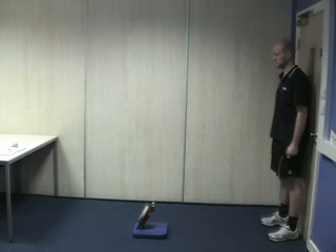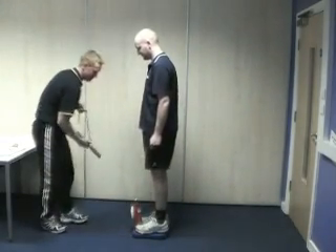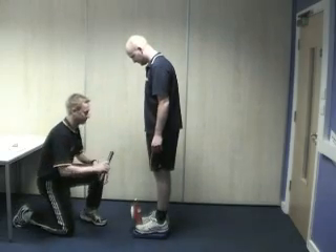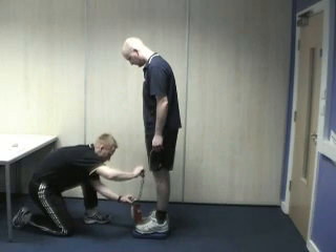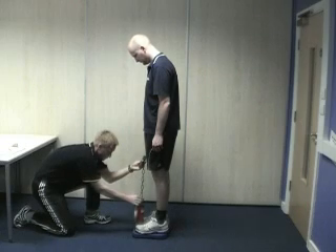The subject should stand on the platform. The tester should link the handle two inches above the knee. This is done by connecting the chain link through the hook.